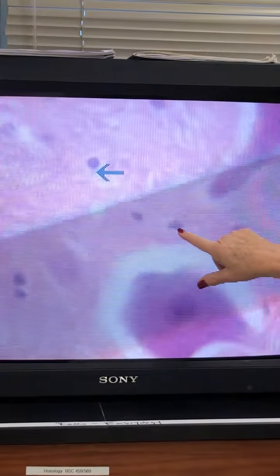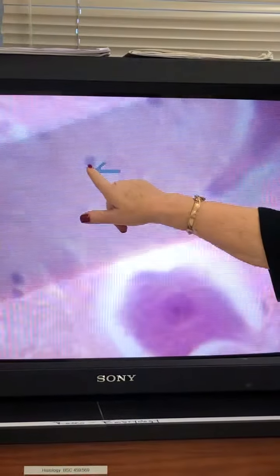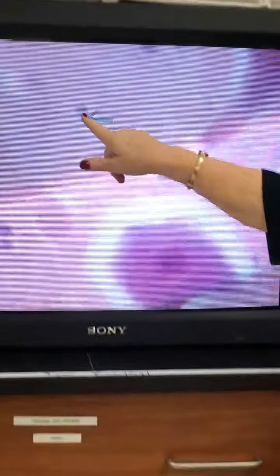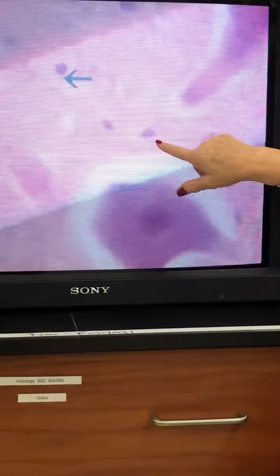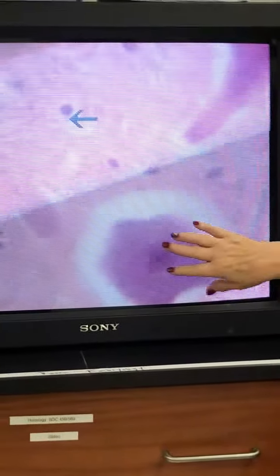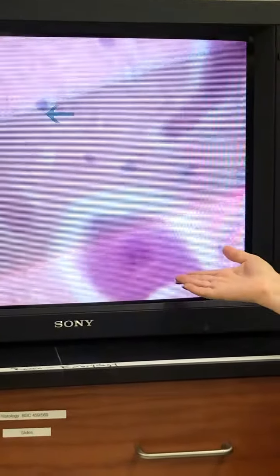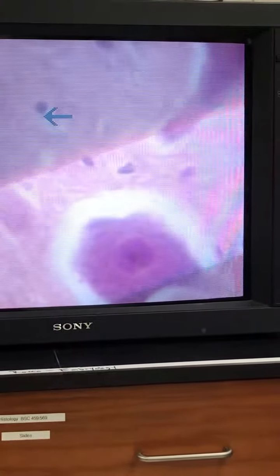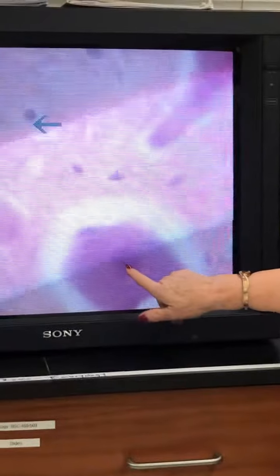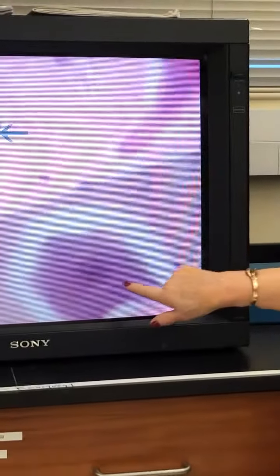What's the name of that cell, as opposed to that one? That one's the oligodendrocyte. Right. Astrocyte. This is the astrocyte. And then these are all the motor neurons or multipolar neurons, depending on how I ask it. Right. Okay. And then that's the nucleolus, nucleus. Then these clumps. Nissl body. Yeah.